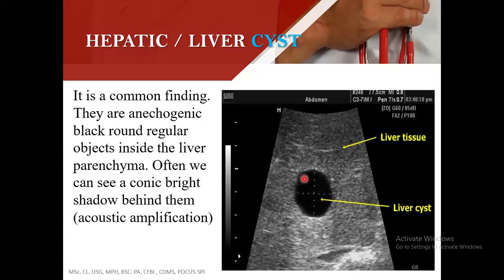And that is one of the reasons why the person doesn't have to eat before coming for an abdominal scan. Because when you eat, mostly the food we eat contains oil, lipids. So the gallbladder will squeeze the bile onto the food, and once that happens, the gallbladder will shrink. So you may not see the gallbladder when the person eats. So it's better you come on an empty stomach. At that time, the gallbladder has its normal size and you measure.